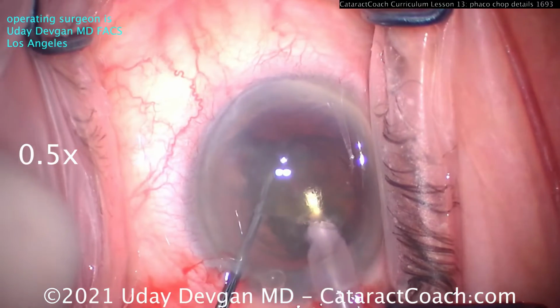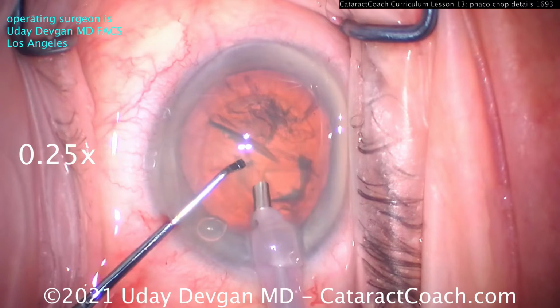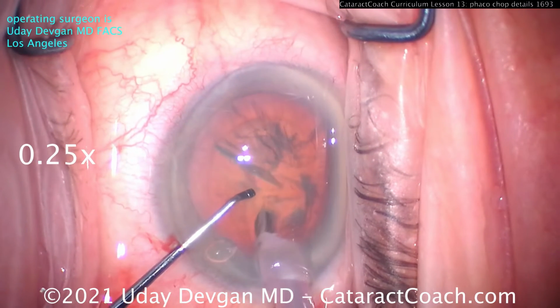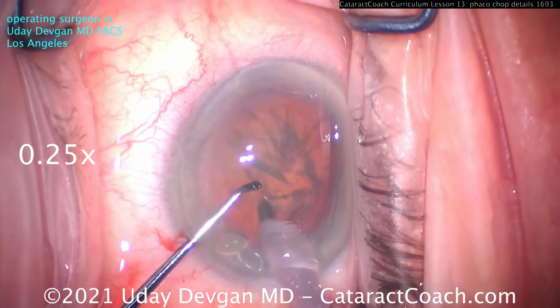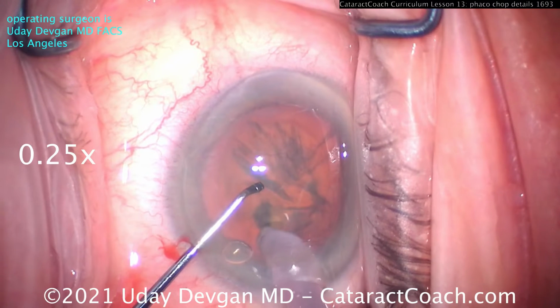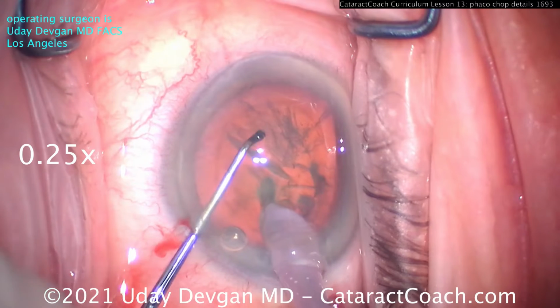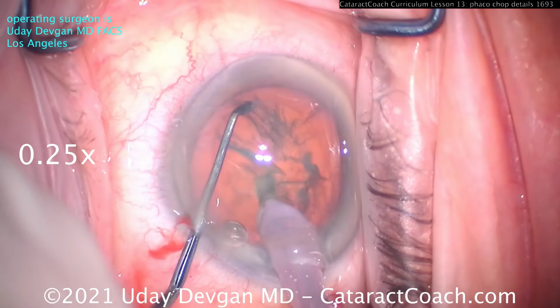Let's watch again in 1/4 speed now. So where's the Phaco probe going? Not the center of the nucleus, subincisional, just inside that temporal rhexis. Embed it till you have that high vacuum, high on the machine. Now, when you have that high vacuum, quickly, without wasting time, embed the chopper within the nucleus.